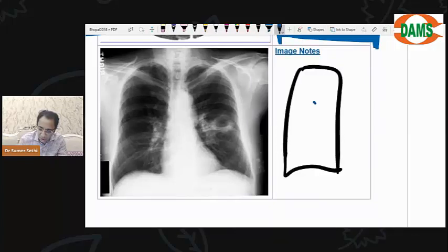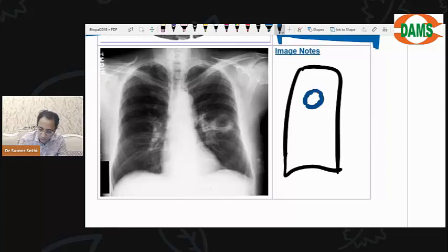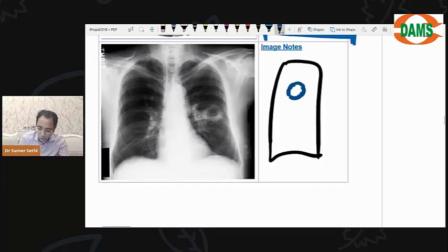That infection leads to some inflammation surrounding it, and then the central part undergoes necrosis and damage happening here because of inflammation. What will happen? You will see a ring-like area of inflammation that is called cavitation.